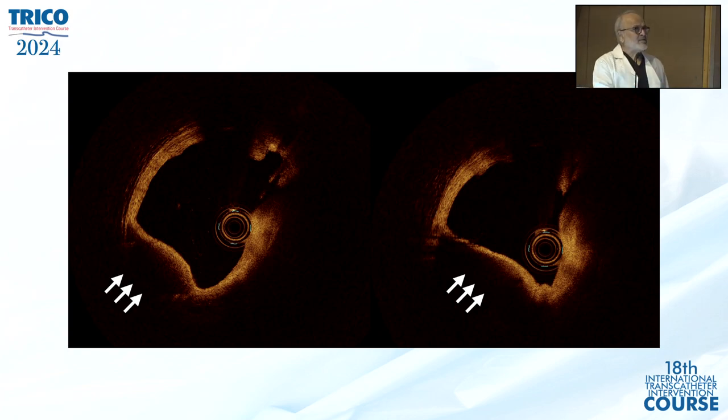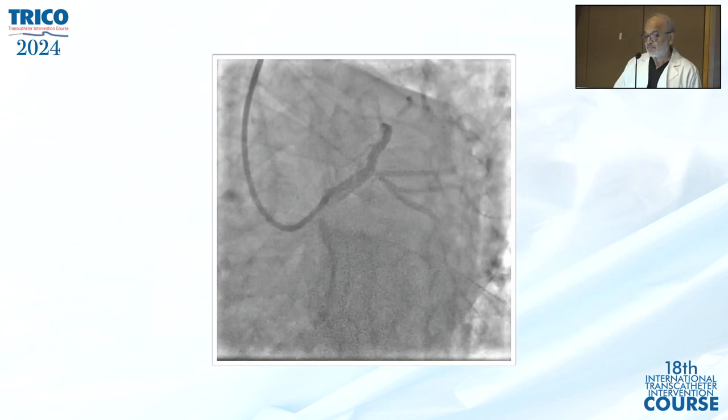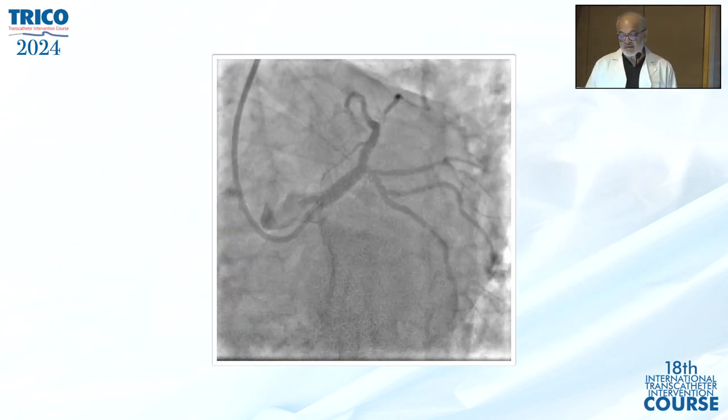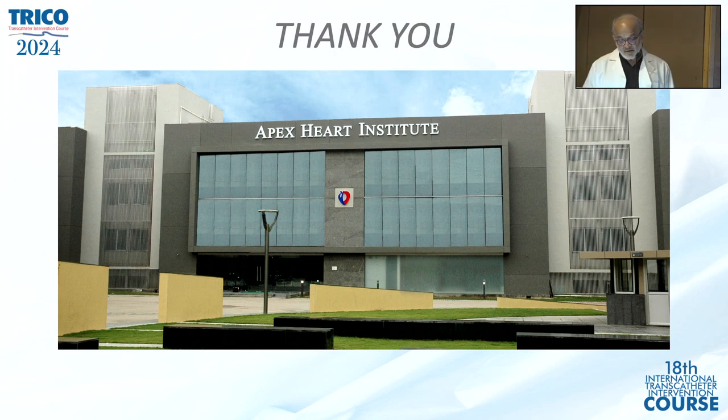We kept the patient conservatively. And now after 3 months, we are going to do check angio. Clinically, at the end of 1 month, patient is doing great. I'm sure that it will get absorbed. We will take the patient again and check with the OCT, circ to left main, and do an angiogram. This result we accepted without touching the circumflex. Thank you very much for your kind attention.